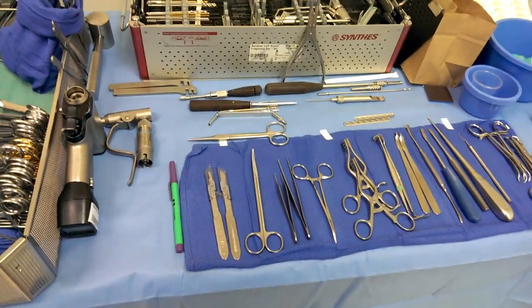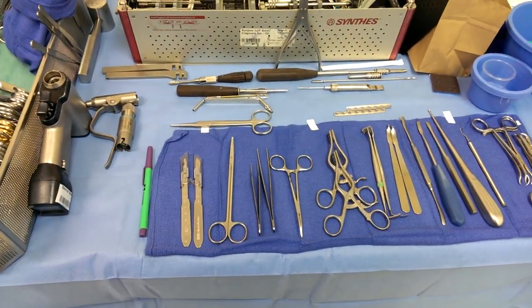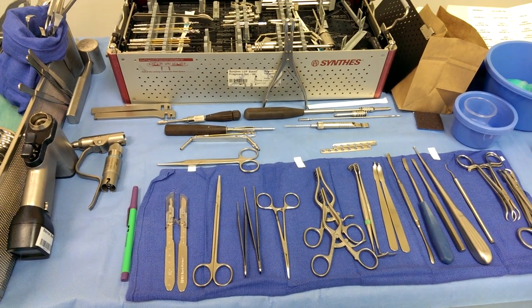Back again with surgical tech tips. Here we are with the ankle fracture — a bimalleolar fracture.